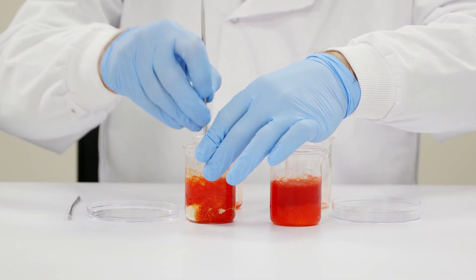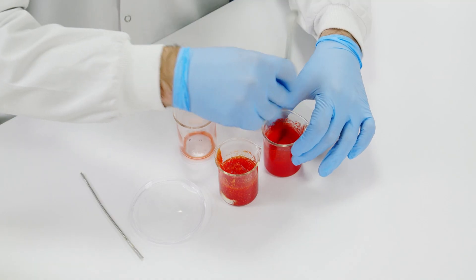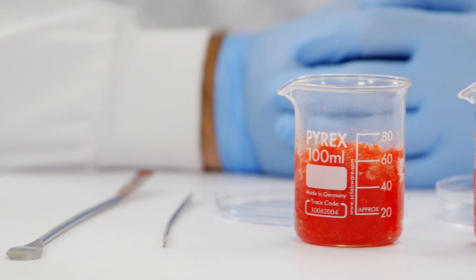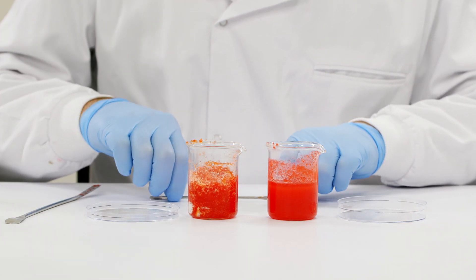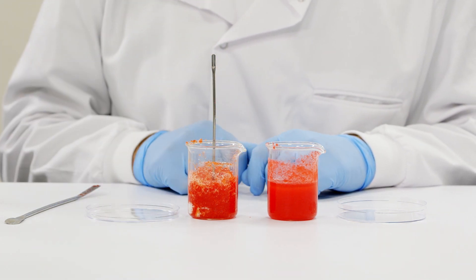You can see as we stir, a gel-like clot is already starting to form with CELOX granules. I'm going to let both stand for 60 seconds to allow it to set. Now the samples have been set for 60 seconds, we are going to place a spatula in each beaker and test how robust the clot is.